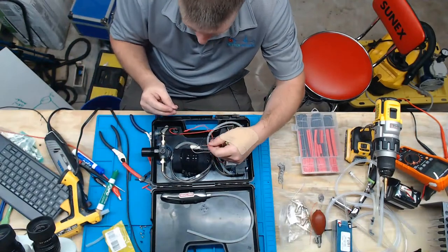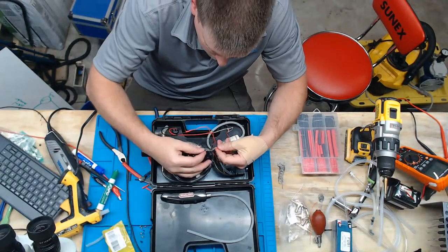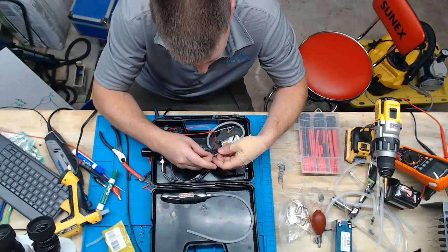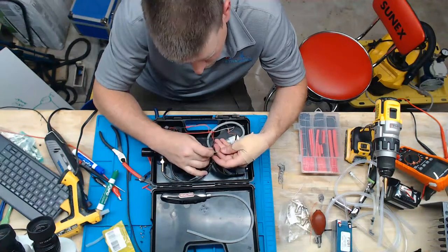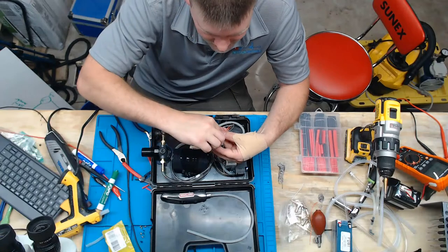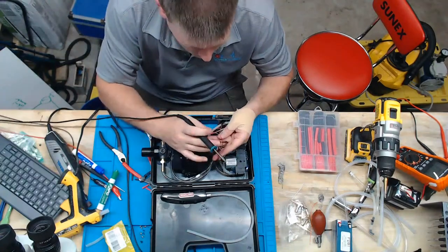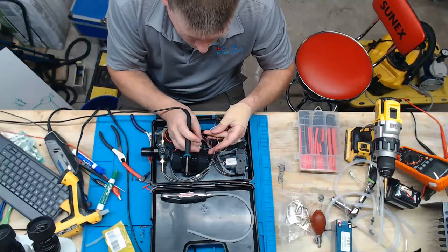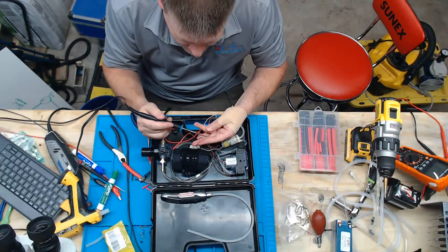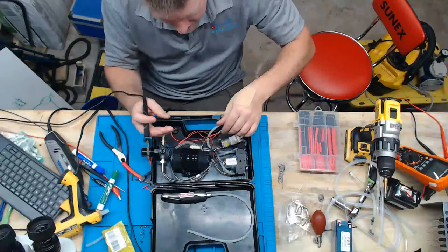I don't even care. Let's see, so the red is going to be my negative, and this should finish up this device. And then I'll turn it on and we can see if it catches on fire, right? I know I should work with shorter wire leads because it neatens things up, but I was just kind of in a hurry. Ah, son of a gun. See, it got me.